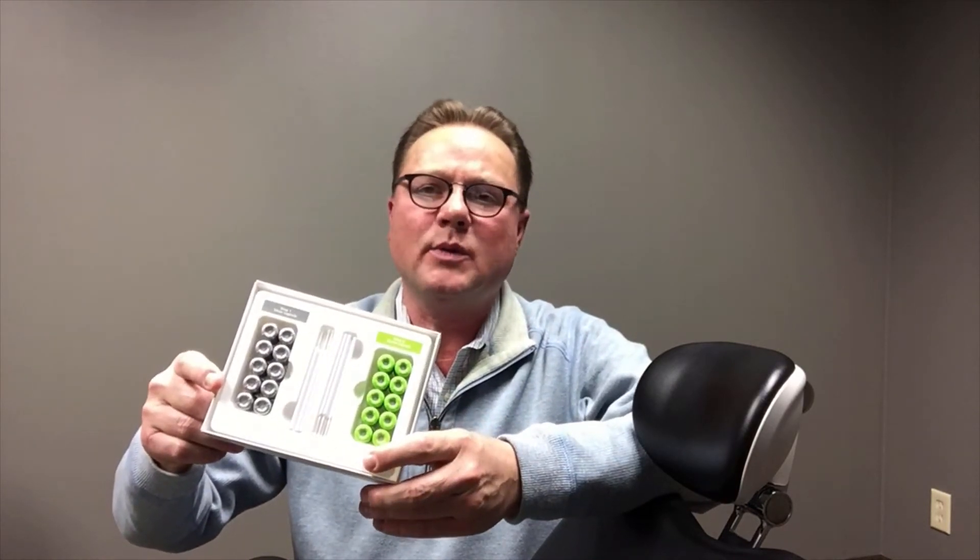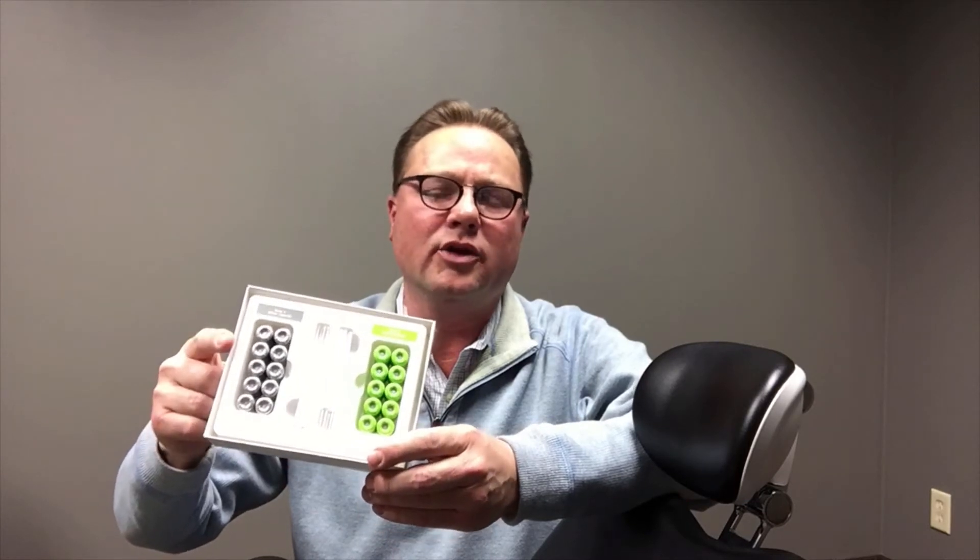SDI recently received FDA approval for us to sell Revastar here back in 2019. Revastar is packaged one of two ways — we make it in the unidose kit that you see here, as well as in a dual bottle system for offices that would prefer that over a unidose.